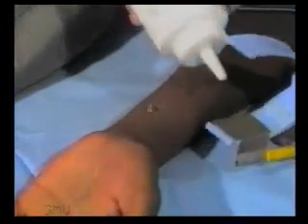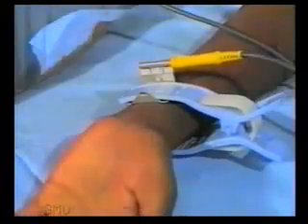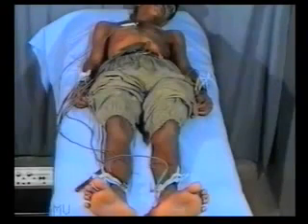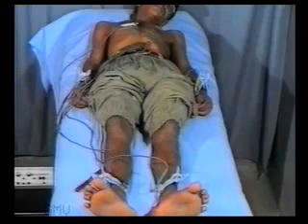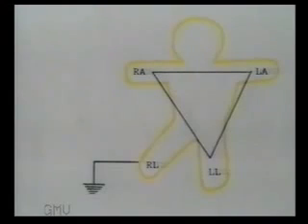The leads are placed in contact with the body surface at different fixed points. An electrode jelly is applied to have proper skin contact with minimal resistance. The 4 limb leads are tied to the 4 limbs over the forearms and the shins, where there are minimal muscles, because muscle twitchings can cause electric interference. The electrode on the right leg is the ground electrode or the earthing electrode.